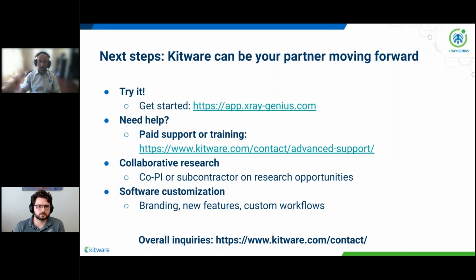So we can collaborate with you and find ways to customize X-Ray Genius that can really accelerate your research project. The last one, and I already kind of described this, in some cases, customers would like to completely customize X-Ray Genius for their own internal R&D, and we can help with that as well.